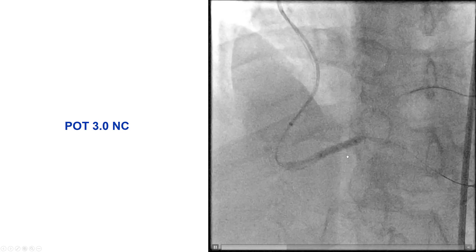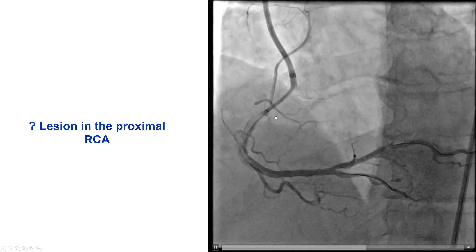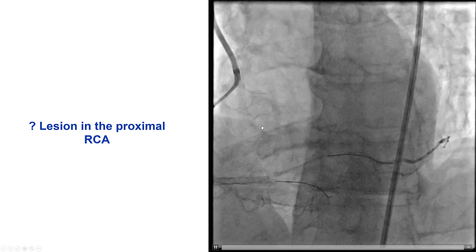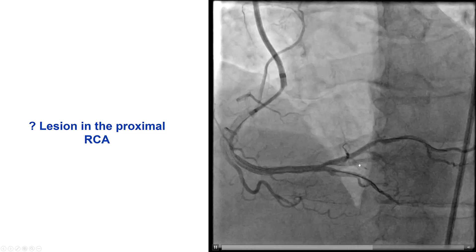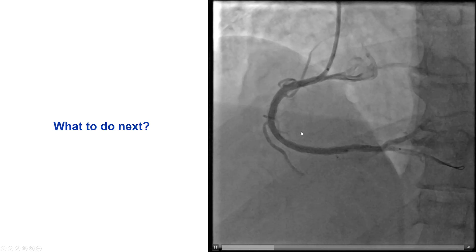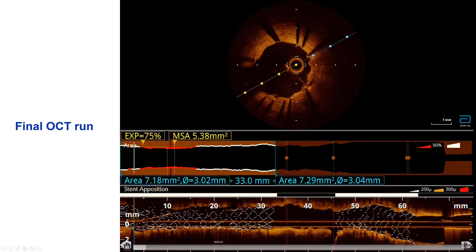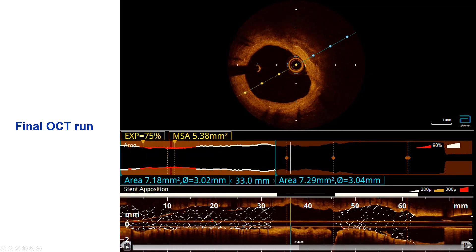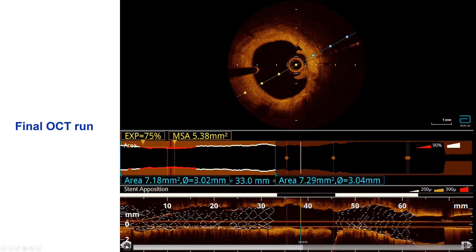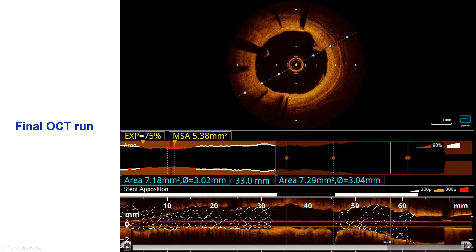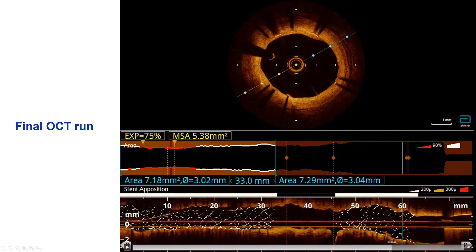We then did proximal optimization with a 3.0 millimeter non-compliant balloon, but there was some area of disease in the proximal RCA where a previously placed stent was located. The question was whether we had caused some guide-induced dissection. The PDA looked okay, so we decided not to place any stents in that area. We re-engaged with a JR4 guide catheter and did another run with optical coherence tomography, which demonstrated a nice result with good stent expansion. There were some areas of mild intimal dissection between the two previously placed stents, but no flow-limiting dissection, so we decided not to place any additional stents.